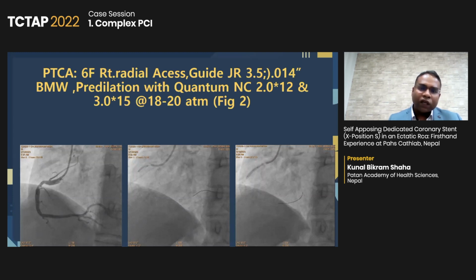As you see, since this is a new technique which is quite different from balloon-expanding stents, we have to keep a few things in mind that I have listed as 5 golden rules to proceed with this case. First is the stent size selection. It has to be very clear whether you are going to use a small, medium or large size stent, depending upon the vessel size.